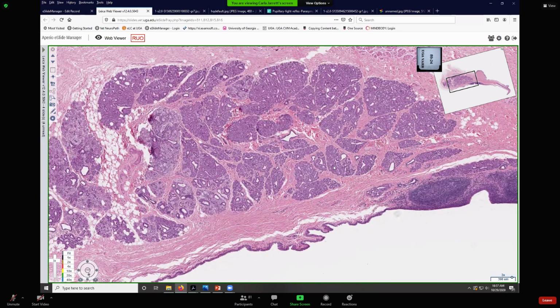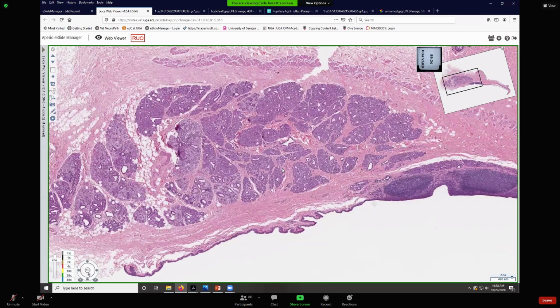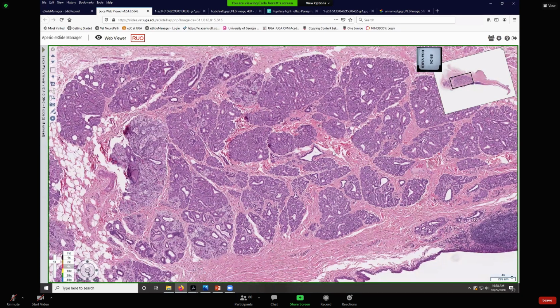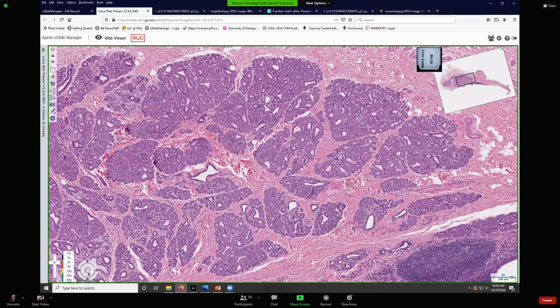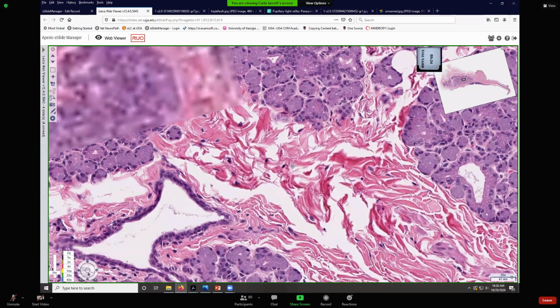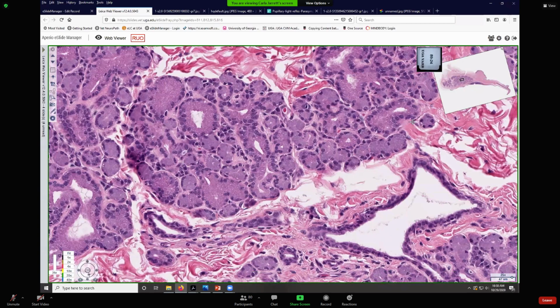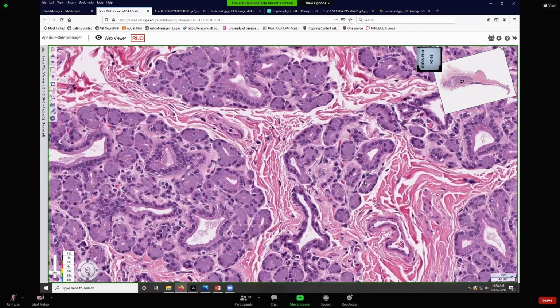And this is the superficial gland of the third eyelid, because in larger species, there's also a deeper one called the, well, deep gland of the third eyelid. In carnivores, there's just the superficial gland. It is a compound gland, meaning it has lots of ducts, and those ducts branch to get to all these individual lobules. It's tubulo-alveolar, branching tubulo-alveolar, meaning you'll see branches in the adenomers. This is a duct right above the adenomere.